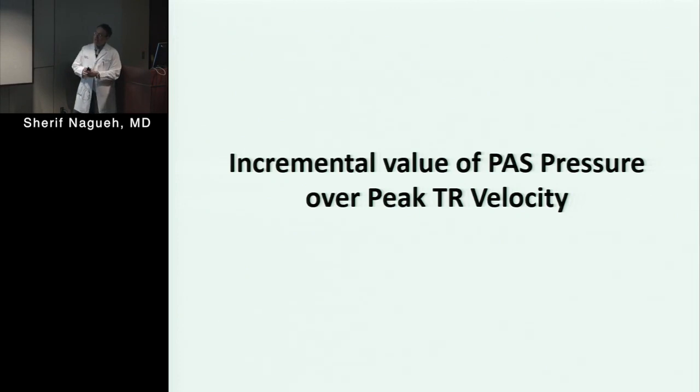Here we have, in a good number of cases, patients where we have both TR and estimates of RAP, so we can answer the question of whether PA systolic adds to the accuracy compared to peak TR velocity alone.